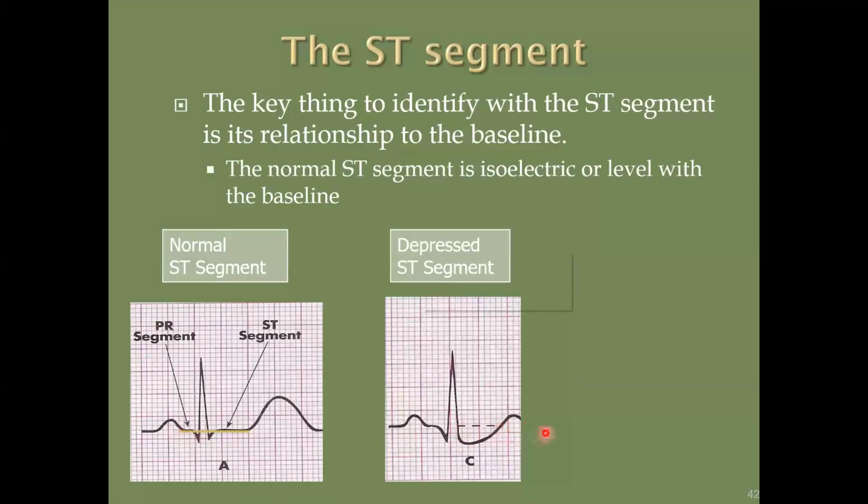And remember, I said earlier that you can have ECG changes because of medications, not used often, but some of your older patients may be on digoxin. And what that will do to your ST segment, it almost looks like somebody took an ice cream scoop and scooped it out. So that would not be indicative of ischemia.